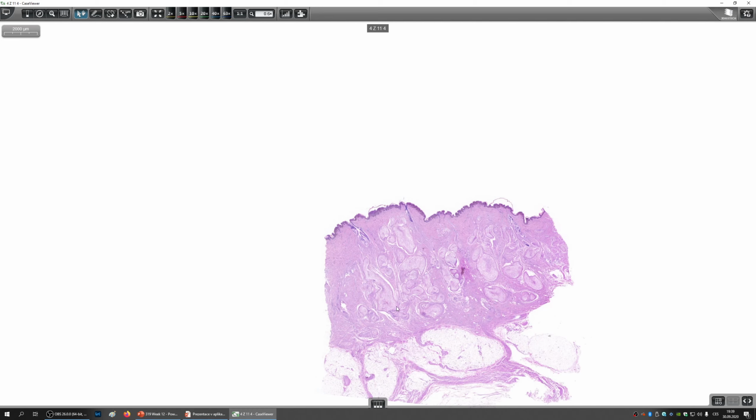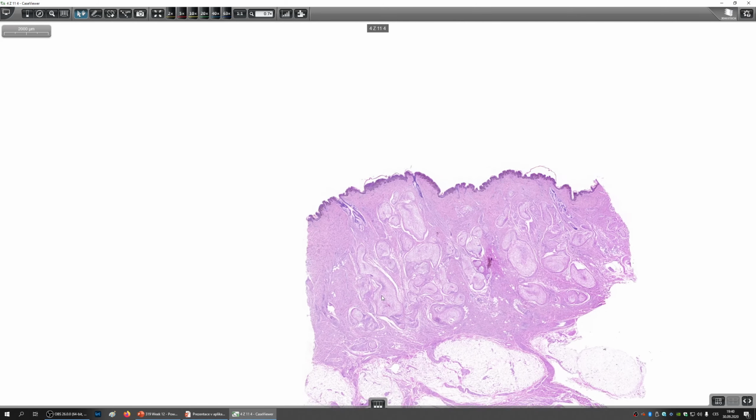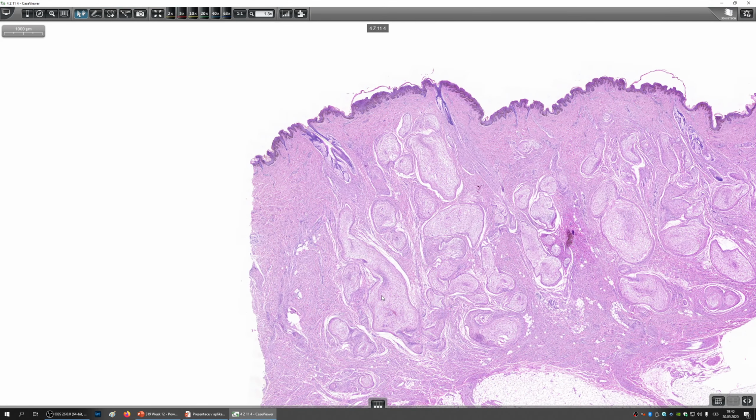So the plexiform neurofibroma is made up of these very big, very coarse fibers. It looks coarse, but it's allegedly very soft to the touch. It's like touching a sack of worms. That is how the feeling is described. I've never tried it myself. Maybe you will get the privilege to try it once. So it's soft but firm to the touch, like a sack of worms.